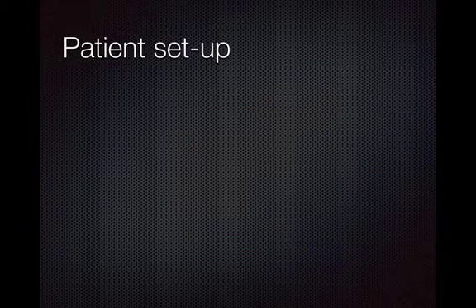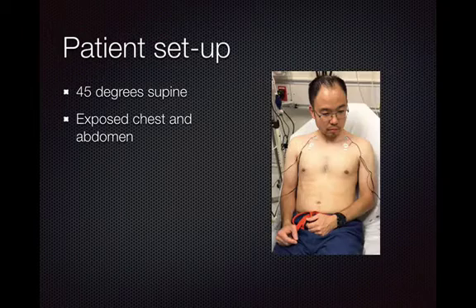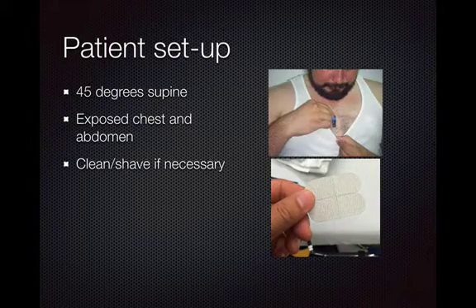So how do you set up the patient? First, you want them 45 degrees supine in the recumbent position like this, and you want to have access to the chest and abdomen, so you want to expose that. And if you need to, in hairy individuals, you need to shave a little bit. The package of the electrodes actually comes with these little skin sanders that can help to smoothen out skin as well.